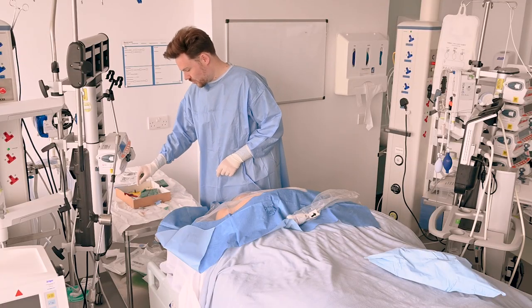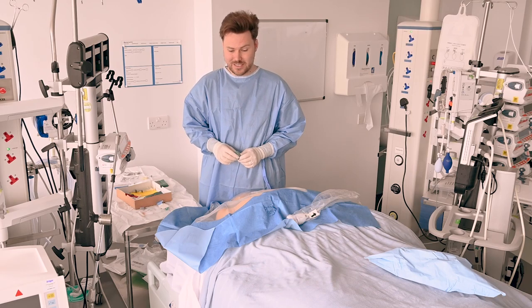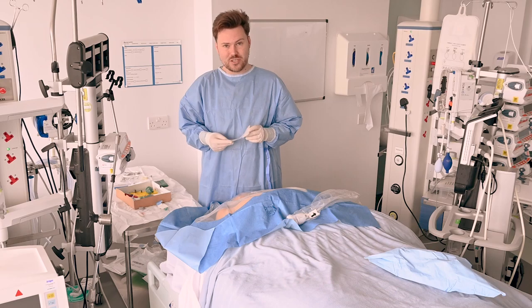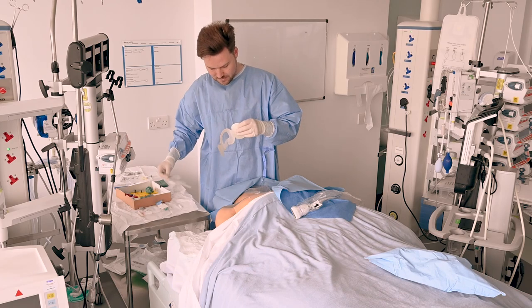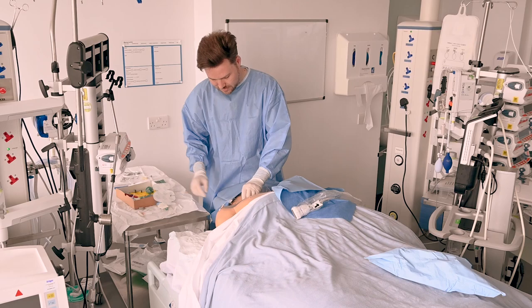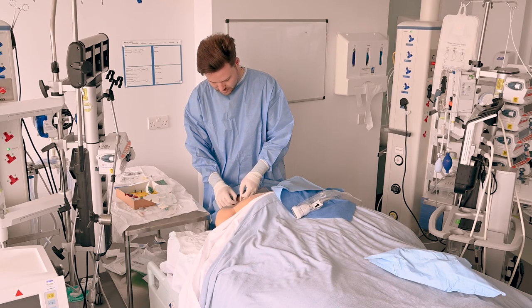To finish up, having aspirated and flushed all my lines, I'm applying sterile caps to everything. I've cleaned the area thoroughly with some wet and then dry gauze before attaching a tegaderm. Our tegaderms in the packs are quite large, so often it's easier to remove the drape and apply the tegaderm afterwards — just make sure that you keep the area sterile. Peel off the backing and attach the drape so that the notched out area sits where your lines are. Pulling the lines through, take off the remaining paper backing including the additional piece — it can be peeled off and secured on top of the back of the dressing.